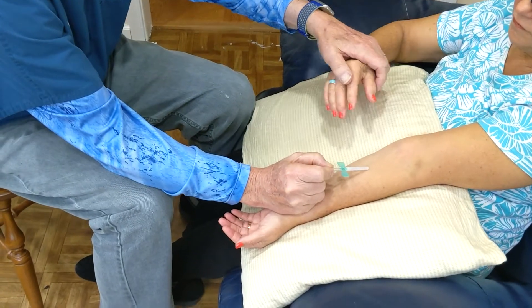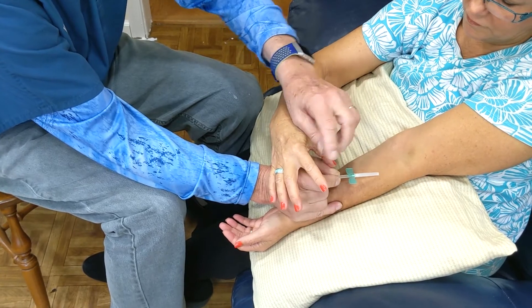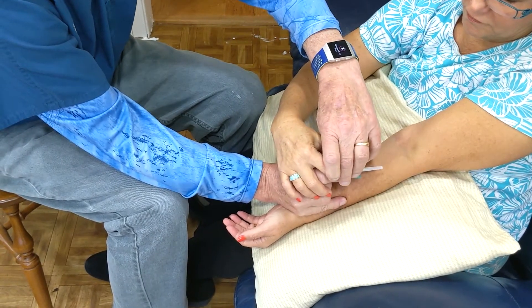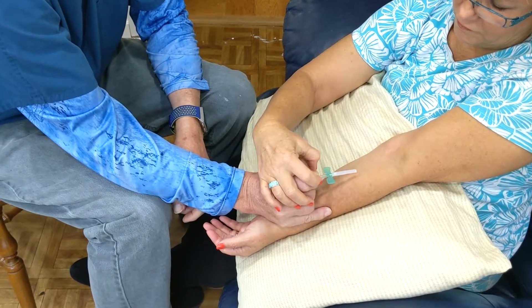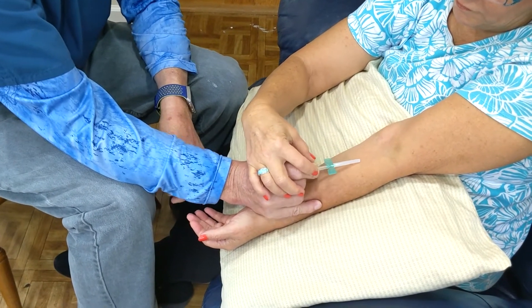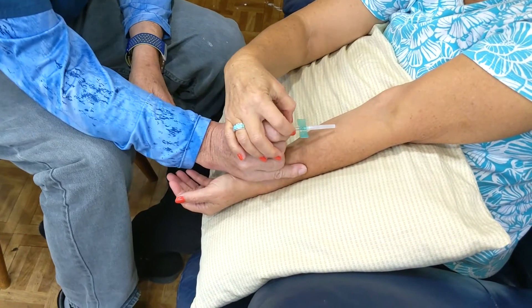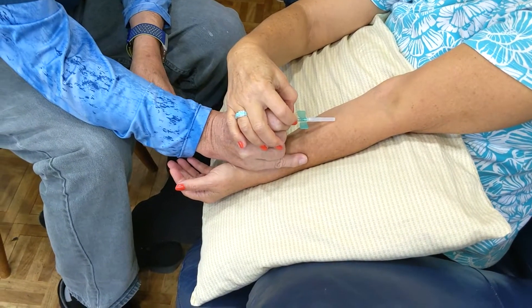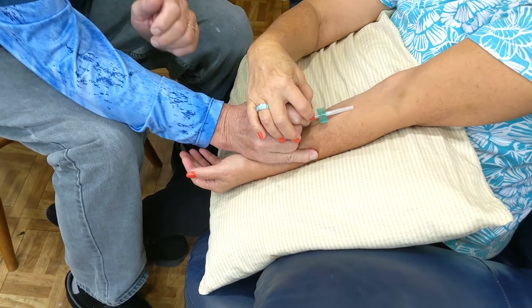Then the patient comes over and puts their hand on top of my hand — the thumb behind my thumbnail and the other finger behind my index finger. Then we just push. The only thing that moves is these two pieces here. As you can see, the patient at the same time feels it, so when the actual cannulation takes place, as I push in, they get to feel everything that's going on with this needle until it goes.